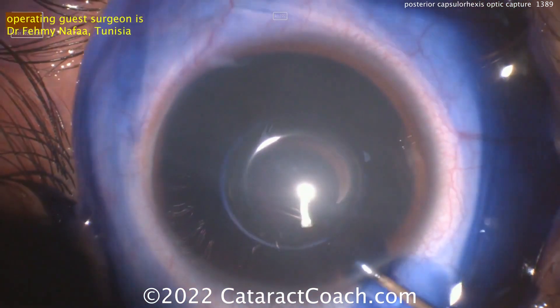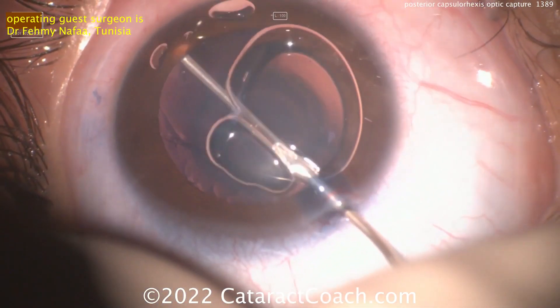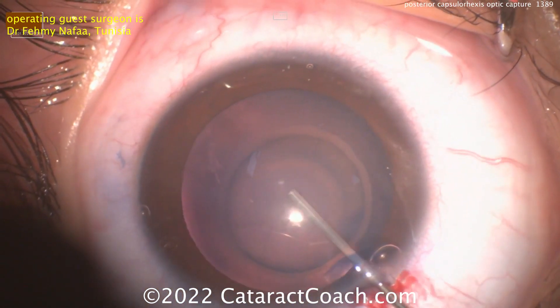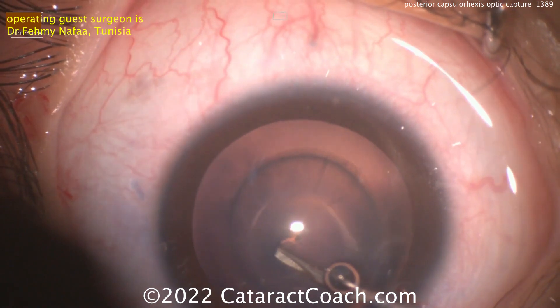Trypan blue dye is very helpful — not just to visualize, but remember, it makes the capsule a little bit less elastic, and on this child it's going to be a very elastic capsule. So viscoelastic going inside the eye here, and you can see there's that cataract, very characteristic of the disease. The rexis is not easy to do in a younger person.